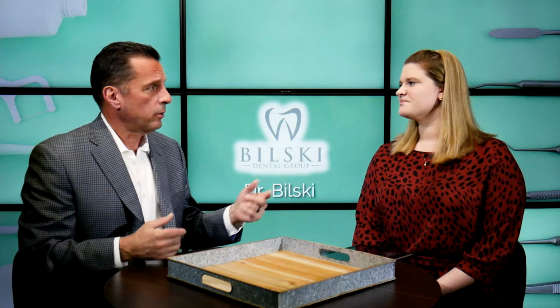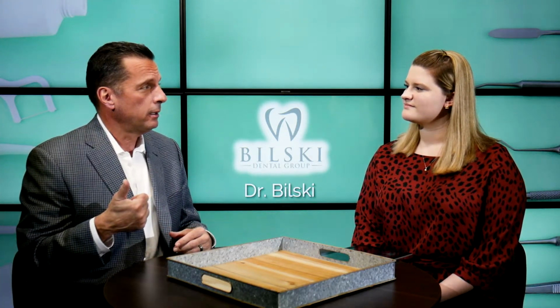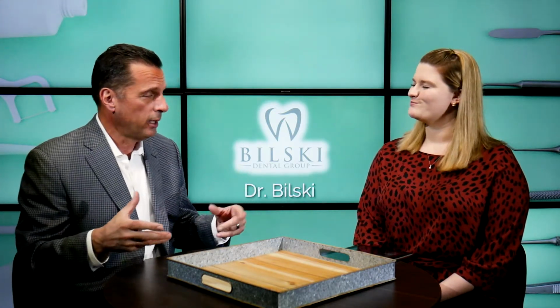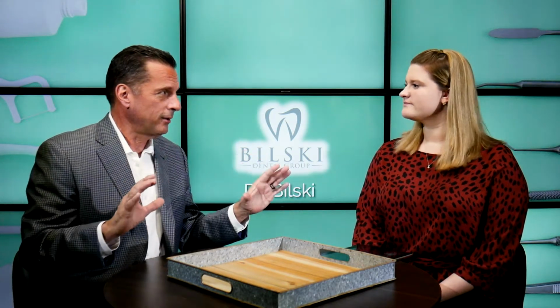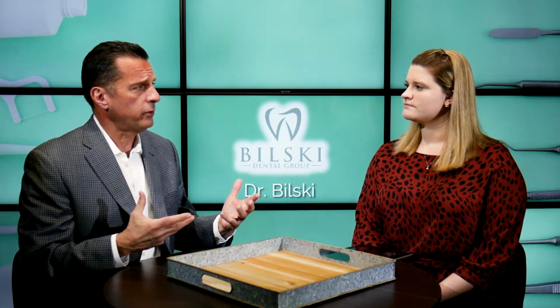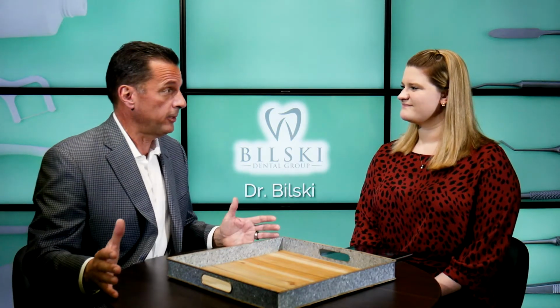Then we use a peroxide cream, make sure that that's cleaned out, rinse it. I call it pool water. It's a chlorine bleach and water solution. Sometimes on severe infections, we use full strength bleach. You're all protected. It's nothing to worry about. It's very safe. Then we allow that to sit for a few minutes. Could be 15 minutes, could be 30 minutes, it could be 45 minutes, depending on the severity.